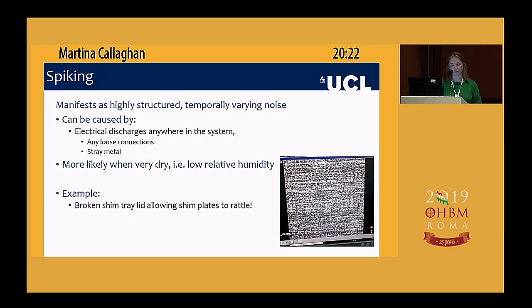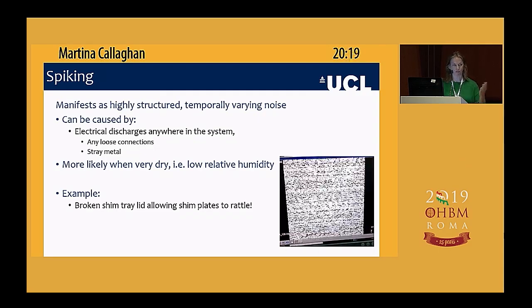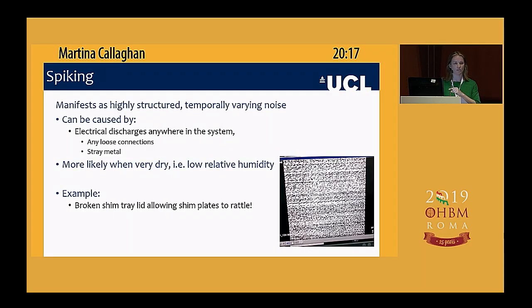So here's a video from one of our systems. And again, I don't know how interesting this is to you, but I found it interesting. This actually turned out to be because the shim trays, which are these trays that go in along the periphery of the bore, and they hold little plates to make the field as homogeneous as possible. So this is done at the time that your system is commissioned. But they're held together with really cheap, basically, little plastic lids that are vulnerable. So in our case, the lid just snapped, and because it wasn't then compressing the plates, they could rattle around, and that's the kind of artifact you get. So imagine trying to pick up some kind of subtle functional-based signal when you have that happening in your system. I mean, it wouldn't be possible.